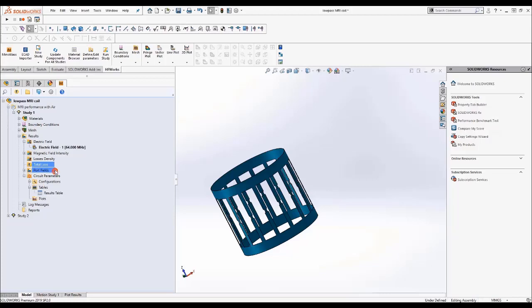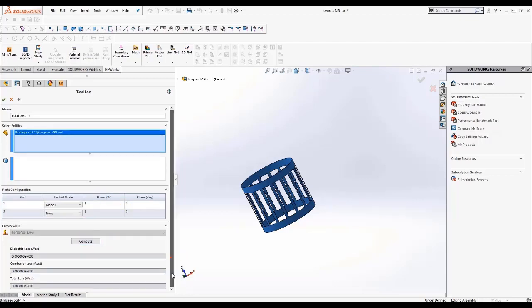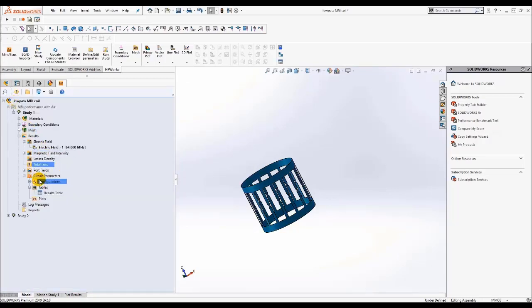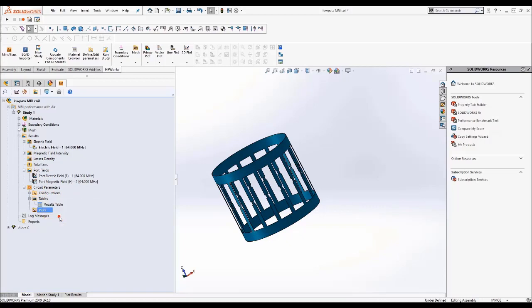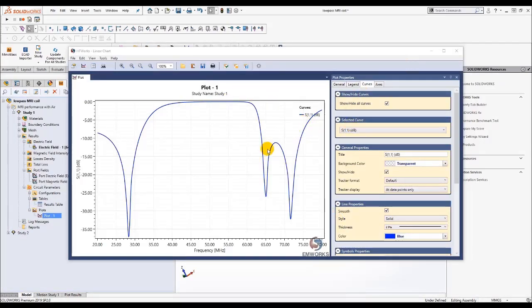You just right click, Compute Losses. For example, to compute losses in our birdcage design, just click, put your input power and a phase, and click on compute. We have dielectric losses, conductor losses, and the total losses. Also for port fields, we have here the electric field port and also the magnetic field. And finally circuit parameters. If you want to check the S11 results, you just right click to plot. Select your type of results, S11 like here, add, and the plot will be opened automatically.